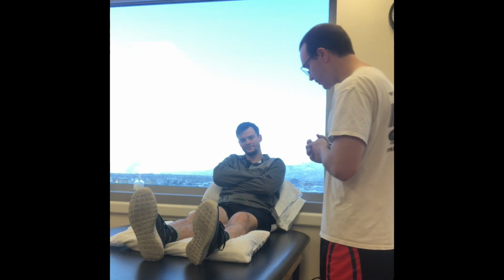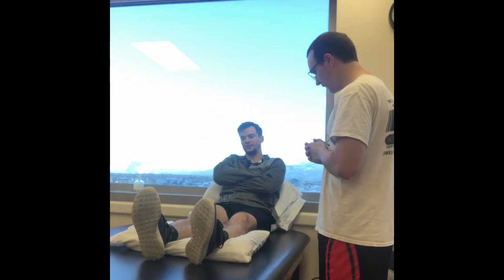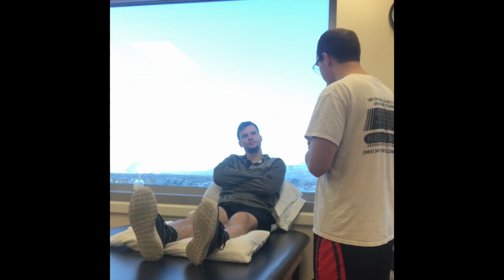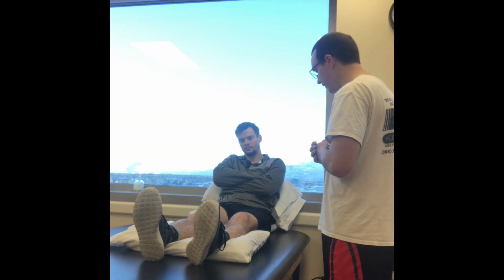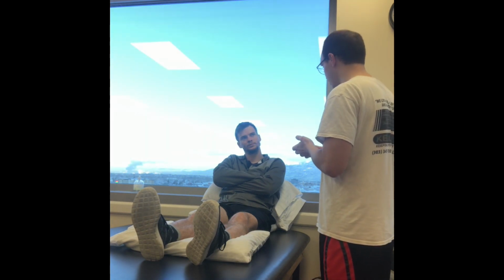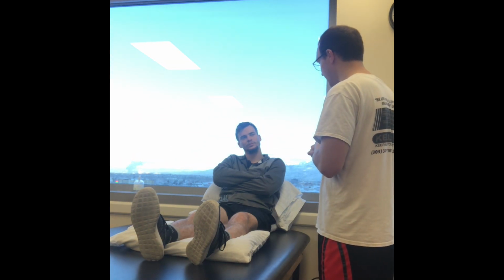So, McLean, how are you feeling today? Doing good. Okay, are you comfortable how you're at? Yes. Okay. So my plan is to do some electrical stimulation to get your quads firing. Now I'm looking at your skin and I don't see any blisters or rashes or anything. So I think we're gonna do that, but I'm gonna ask you some questions first just so I know we're safe to do it. Have you ever been diagnosed with a deep vein thrombosis?